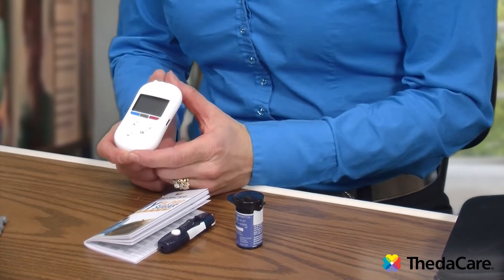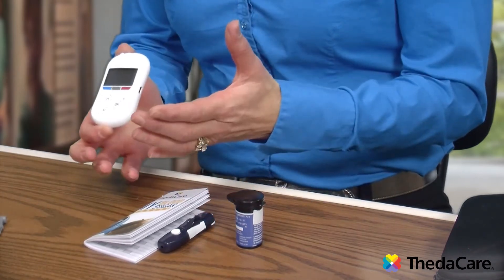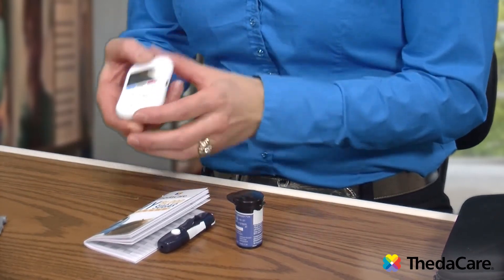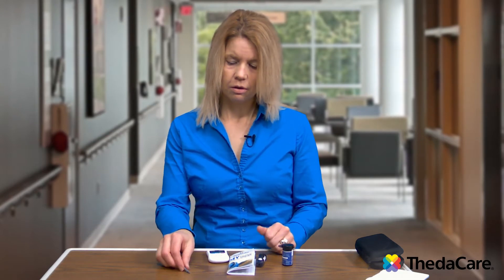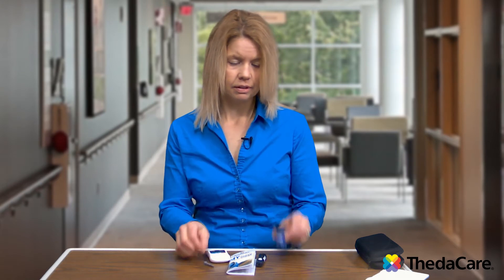With each meter, when you first get a meter you're going to get a kit in a box, and it's going to have a glucose meter. It will have some form of lancet device, hopefully some lancets — which are the needles that you use to poke your finger — and then test strips.